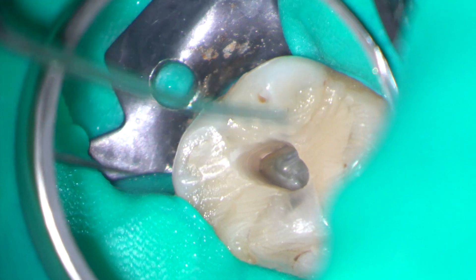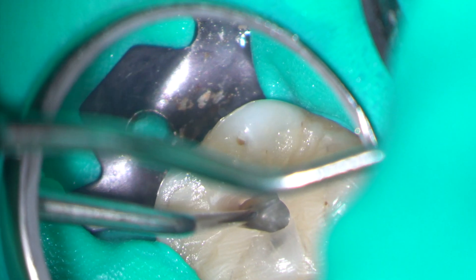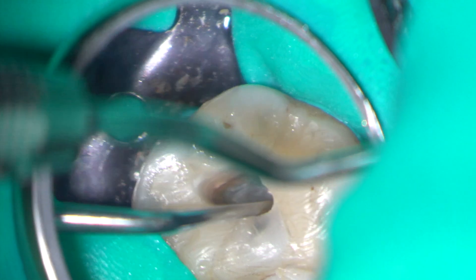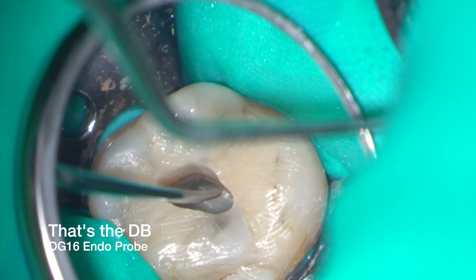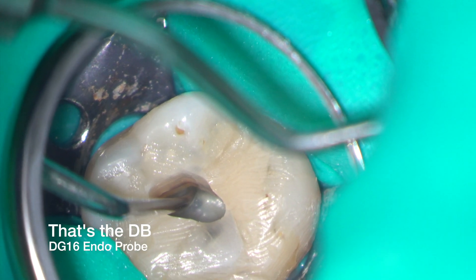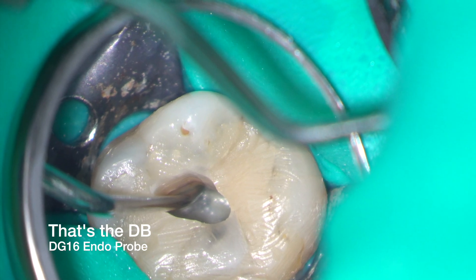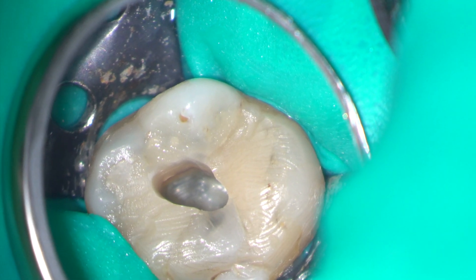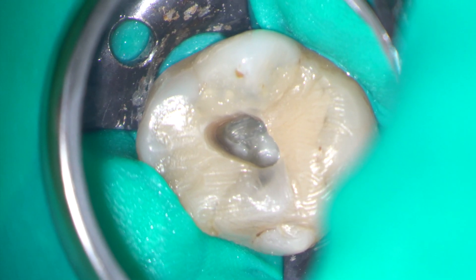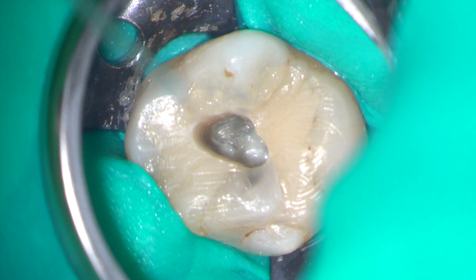I've now uncovered the lateral aspects of the floor of the pulp chamber. Using the DG-16 I can see where the orifices of the MB, the DB and the palatal canals should be. The orifice of the DB canal was easy to locate as was the palatal.